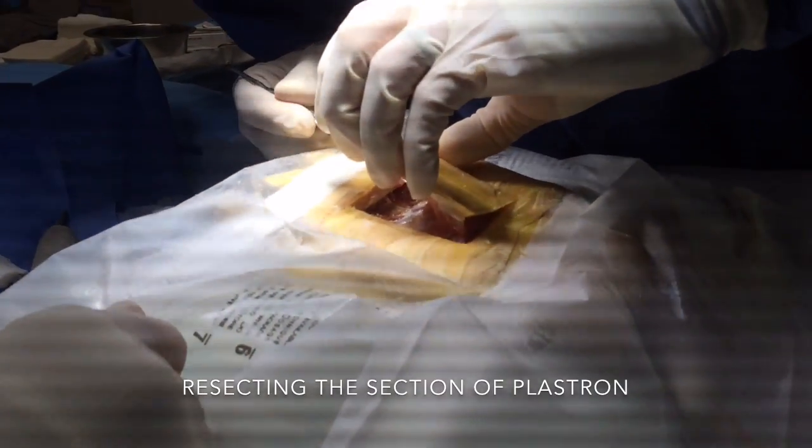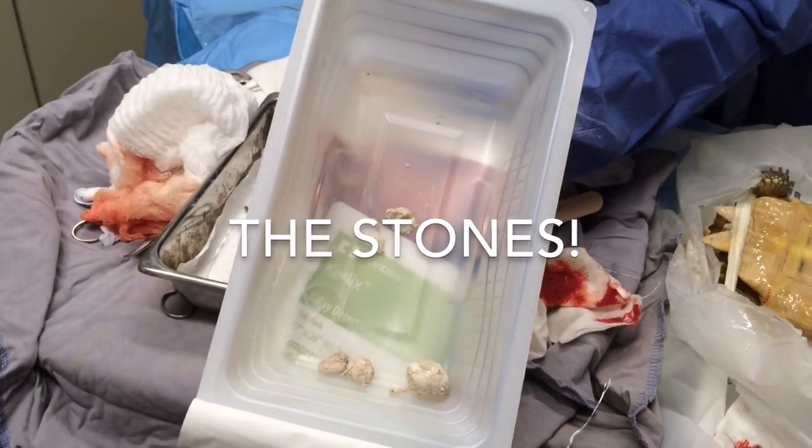You must be very careful when removing the plastron. Pretty nasty stuff.